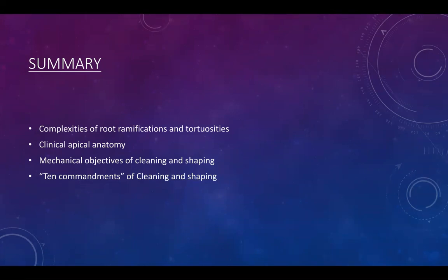So we're seeing that every time we're getting more information, but this lecture was mainly at the beginning about anatomy. And since the first textbooks about anatomy, they were very good. Even nowadays we have micro CT, which is different from CBCT. CBCT is what we use in patients, when we're in the office and we refer the patient to get a report. The micro CT, we can only use it in vitro. We can only use it for extracted teeth. The amount of radiation is more. And that's the one that's used for studying the internal anatomy more precisely nowadays.